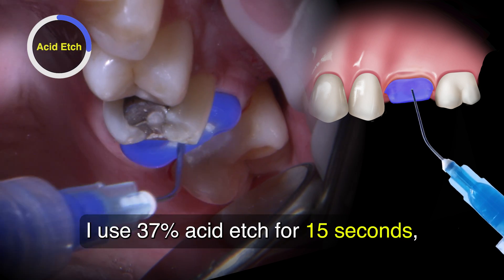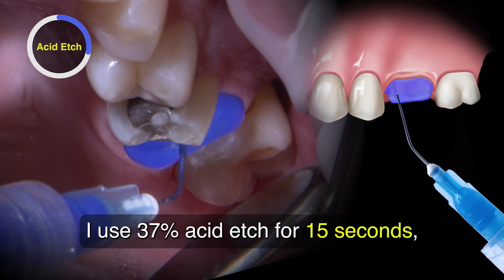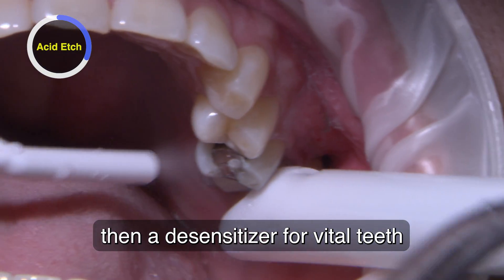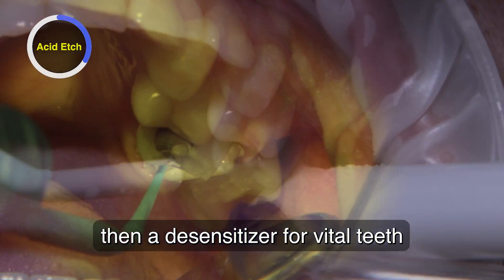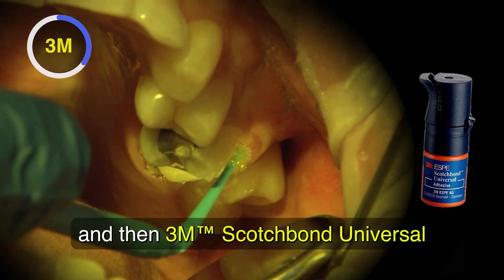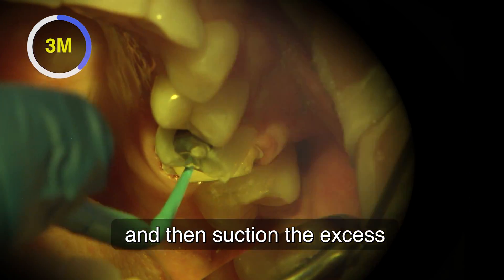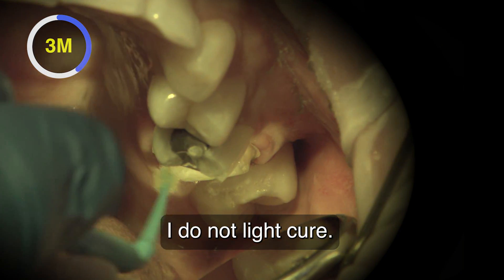For the tooth prep, I use 37% Acid Etch for 15 seconds, a 20-second water rinse, then a desensitizer for vital teeth, and then 3M Scotchbond Universal adhesive scrubbed in for 20 seconds. Then suction the excess to a thin layer.